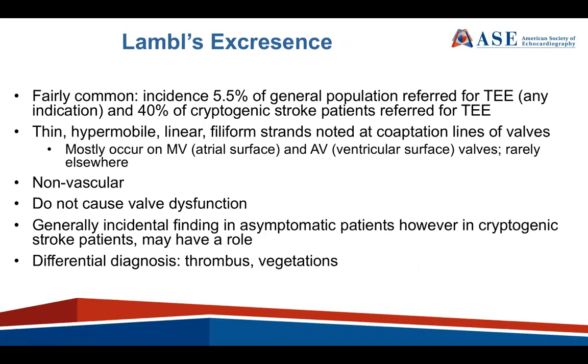Okay, so now we'll talk about Lambl's excrescences. So these are fairly common. The incidence is 5 to 6% of the general population referred for a TEE of any indication, and 40% of patients with cryptogenic stroke referred for a TEE. So you can tell already from this demographic that patients with stroke sometimes have these in almost half the cases, and they can be associated with stroke. They're thin, hypermobile, linear, filiform strands, usually located at the coaptation lines of valves.